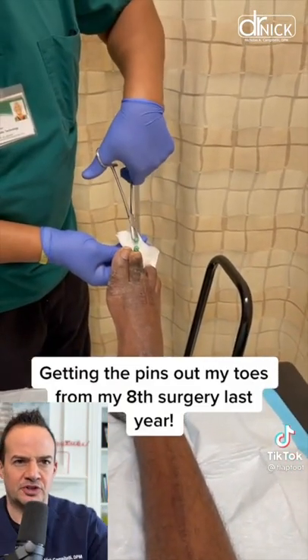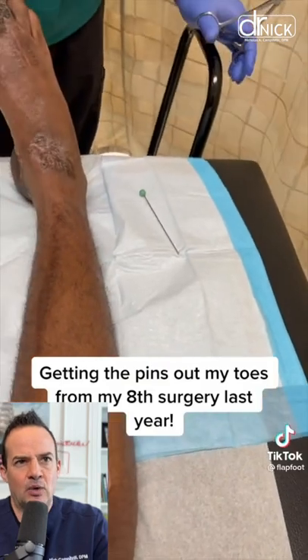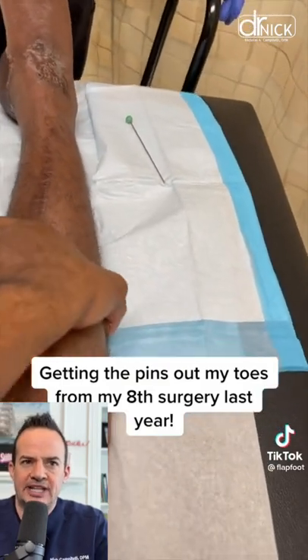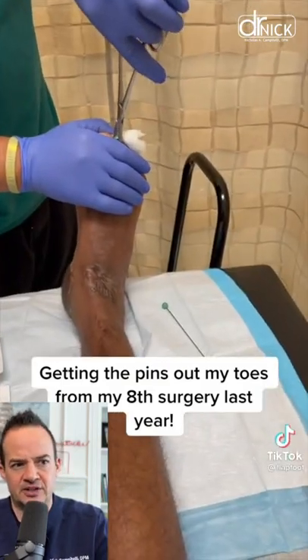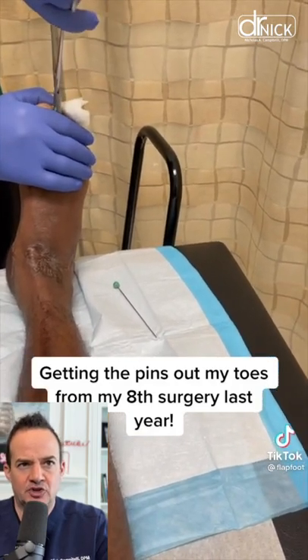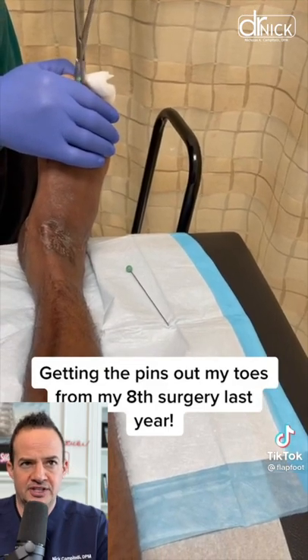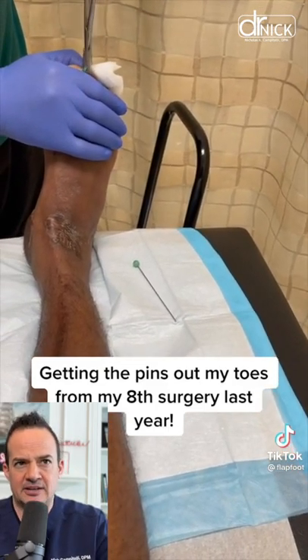This patient had multiple foot surgeries after a trauma, and you can see they're removing K-wires, which are inserted into the toe or sometimes even into the foot after a fracture or hammer toe surgery to keep it straight during the healing process. They're twisting the wire here, which is very common because the wire gets stuck into the bone and sometimes it's hard to get out.